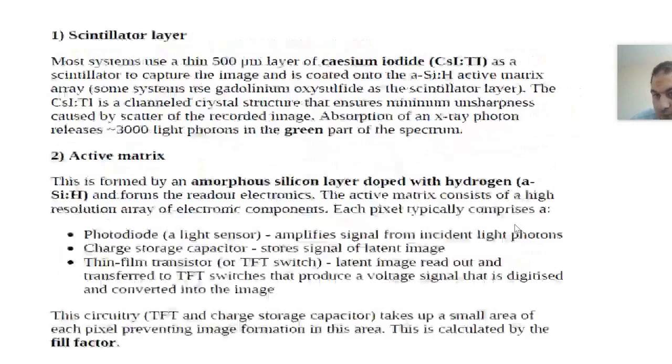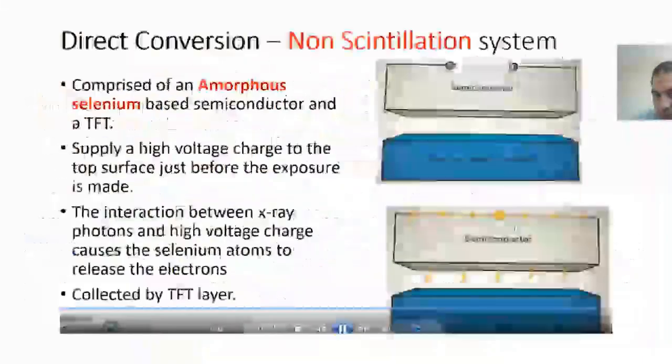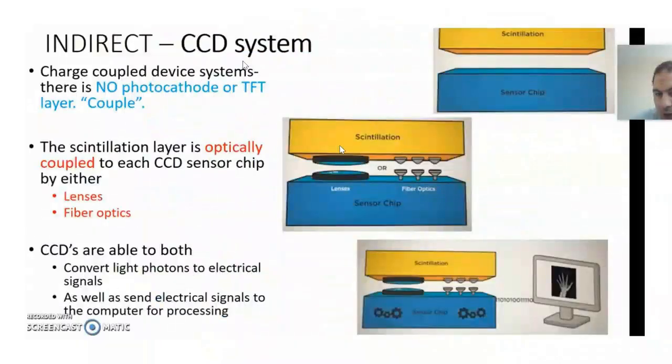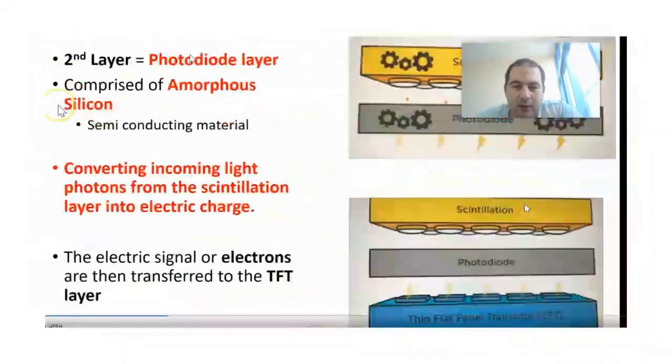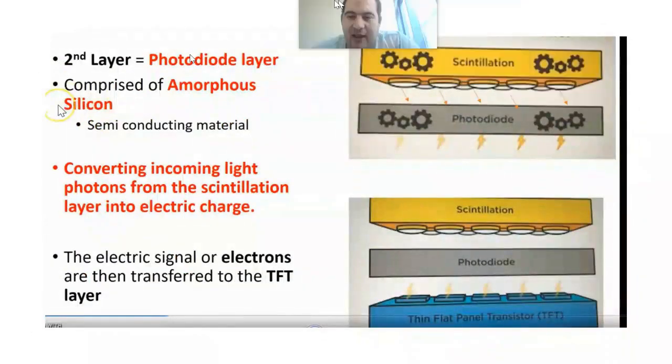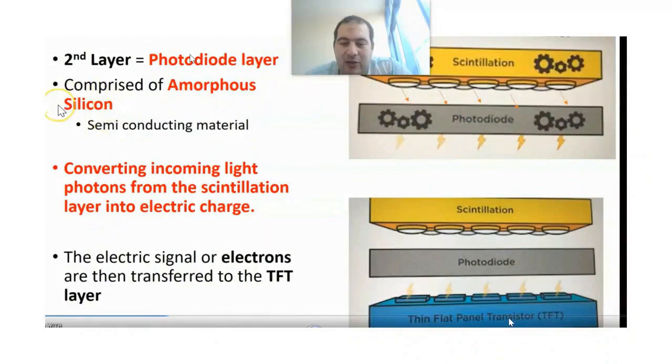Is there a difference between TFT and charge coupled device? The difference between this and that? Yes. The TFT is considered better than the charge coupled device. Why do I prefer it? Because when you look at the thin film transistor here, it is like the chips that are present. It represents the idea of the matrix, doctor.